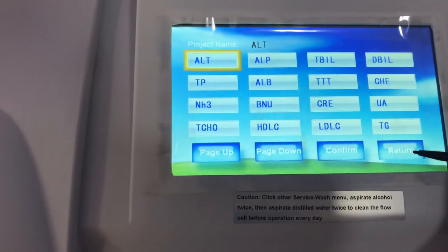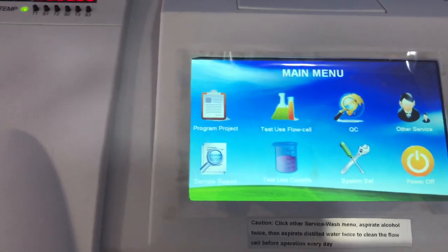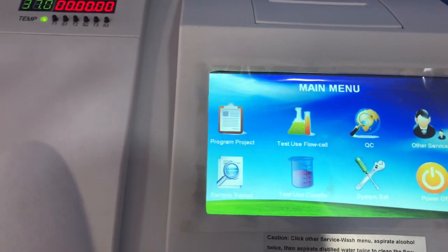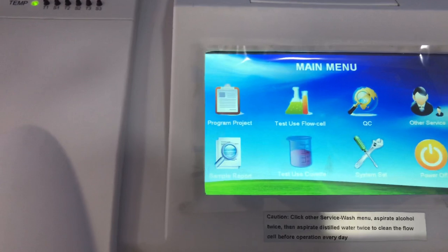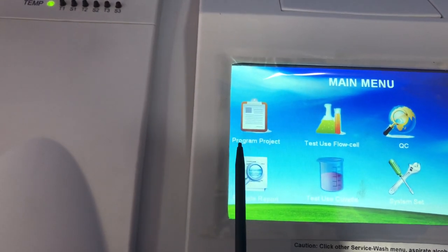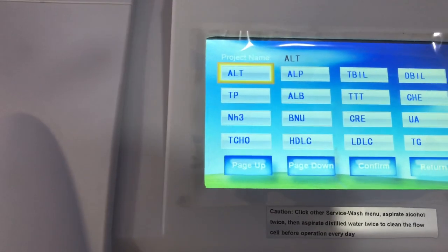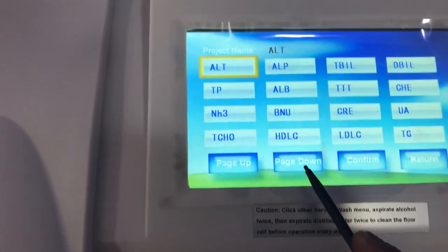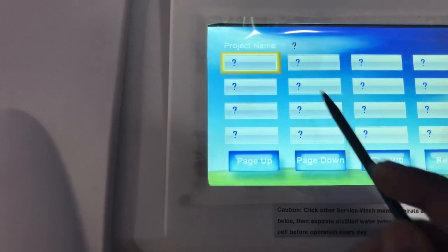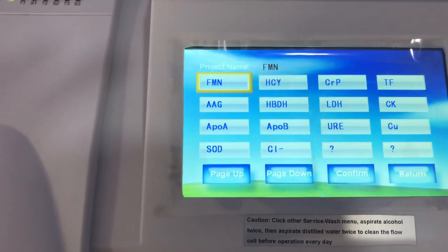We go back to where we have our different test parameters. Now, before you run sodium, you have to program the machine according to the manufacturer's instructions. To program the machine, you come to the program section. Any parameter you want to program, you can select it here. If what you want to program is not in the list, you can scroll further down and click on any of the question marks to begin programming whatever parameter you need.